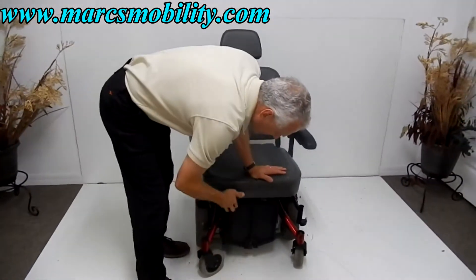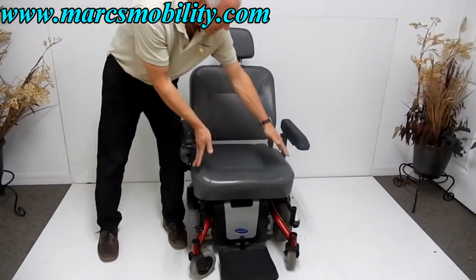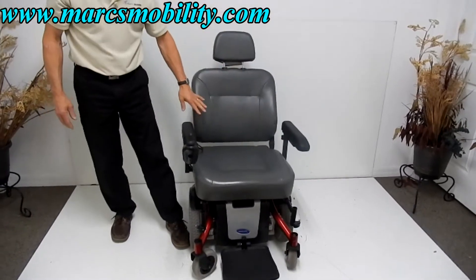The foot plate can be raised up for easy exits. You've got a 21 by 21 inch seat — very nice and fairly large.